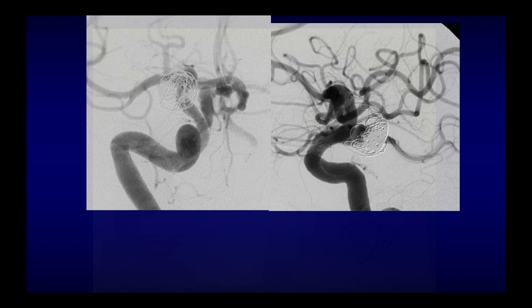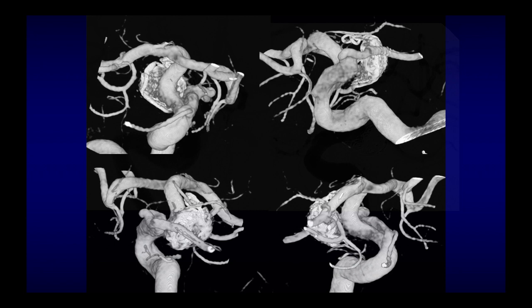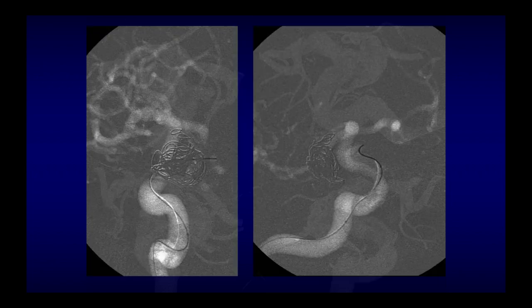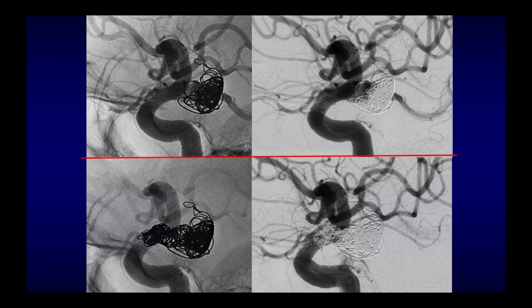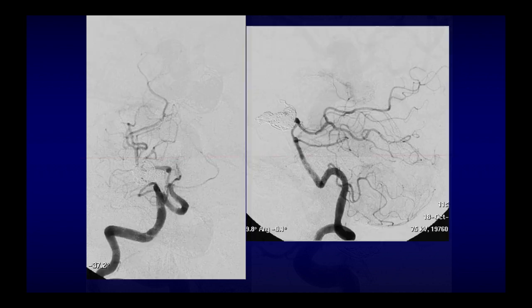So there is a solution to that, which is to go back into that channel and occlude the aneurysm and the channel with coils. You can see the channel which separates from the internal carotid artery. And so we put, this is what we found. We went through the channel with the catheter. We put coils, and occluded the aneurysm and the channel, as you see here. So it's a separate channel compared to the carotid artery.